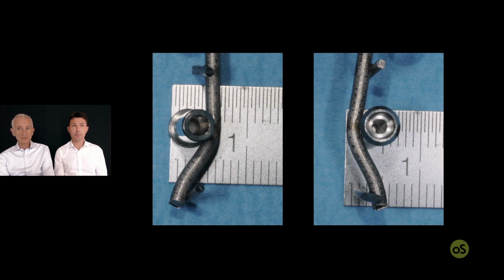So if your lab technician makes shells that are wider than 10, it may look easier for you, but you can be confused and misled during the intraoral relining procedure, because the shell is too wide, so it accommodates, but mistakenly. Okay, so it can confuse you. So it is better that you follow Gianluca's advice. So make a shell that is 10 millimeter in the wider part and 8 millimeter when it comes to the embrasure area.